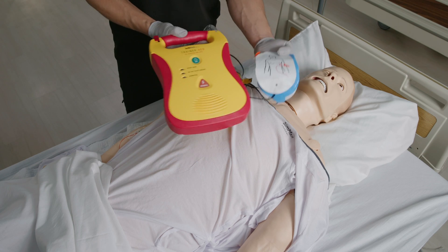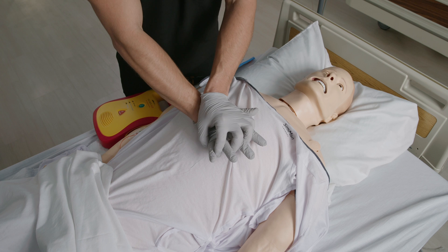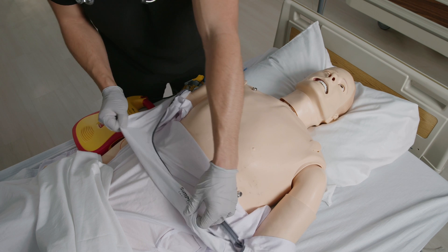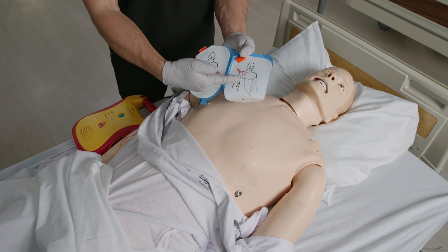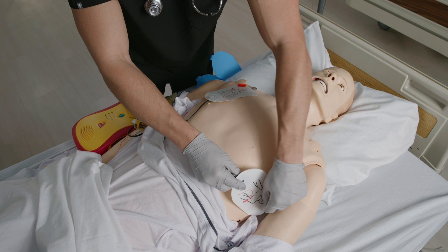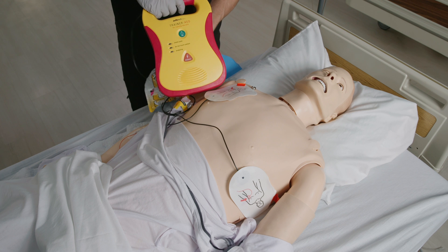AED steps for a non-breathing adult or a child older than 8 who weighs more than 55 pounds. Assuming CPR steps are in process, use the AED as soon as available. Turn the AED on and follow the voice prompts. Remove clothing that covers the chest and attach the pads by placing one on the upper right side of the chest and the other on the lower left side, a few inches below the armpit. If the pads touch, place one pad in the middle of the chest and the other on the back between the shoulder blades.